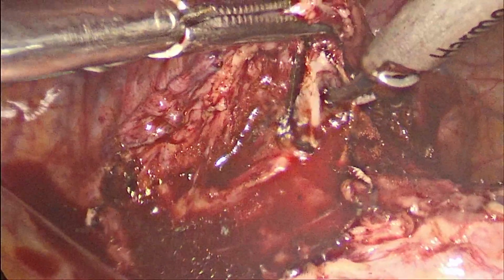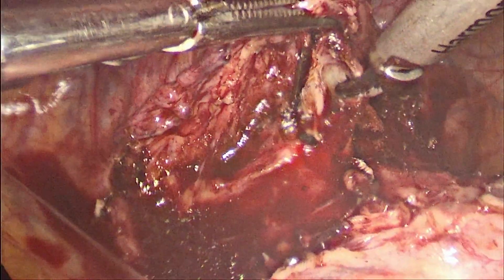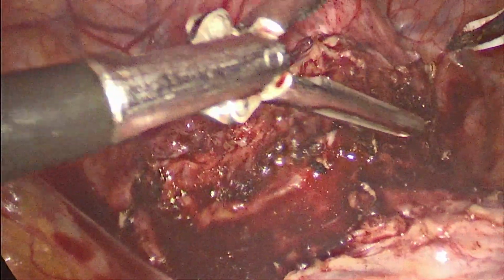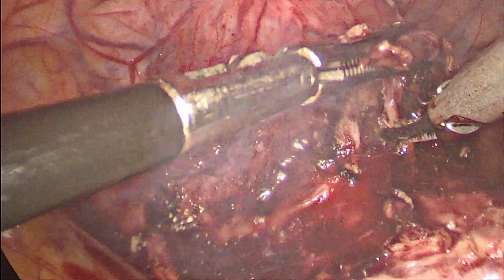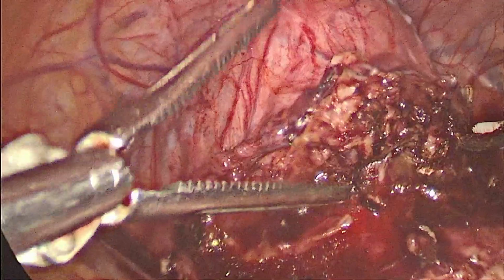So now we have the bladder properly separated, well away from the cervix. Now we are getting the proper plane. Once we identify the plane, it becomes very easy to separate the cervix from the bladder. Till we get this plane, we should be very delicate in our dissection.